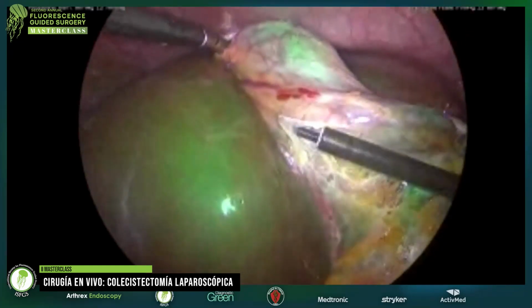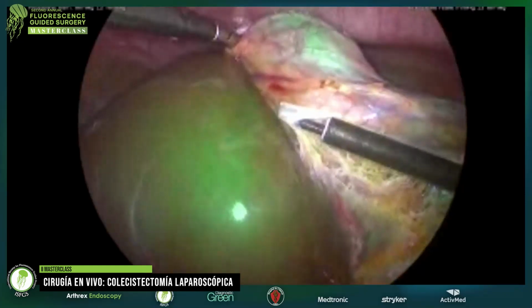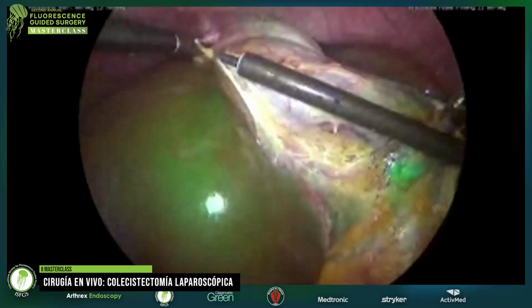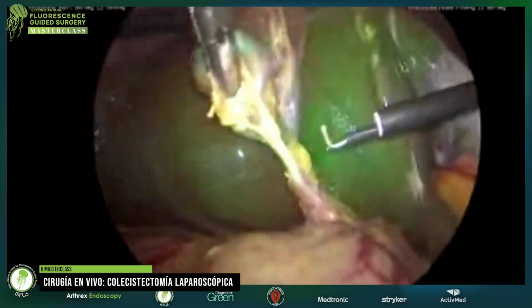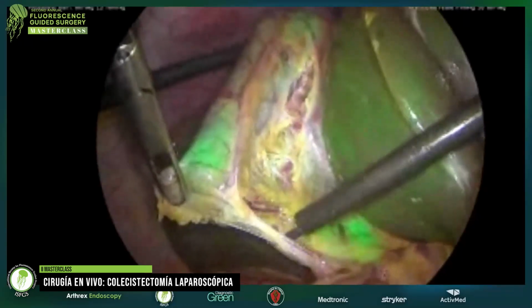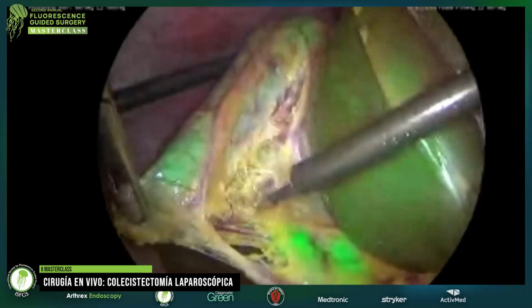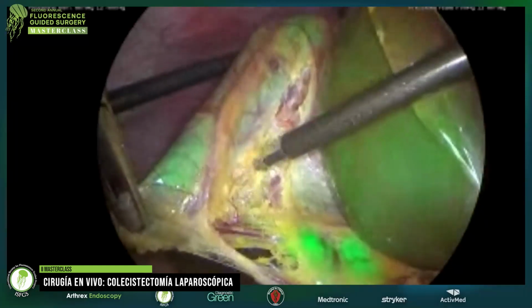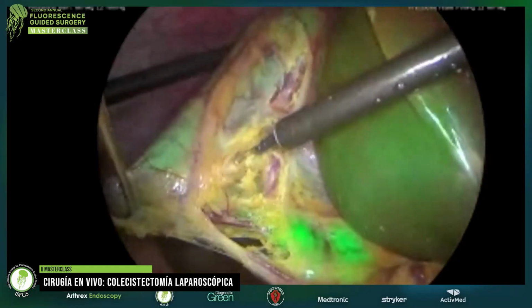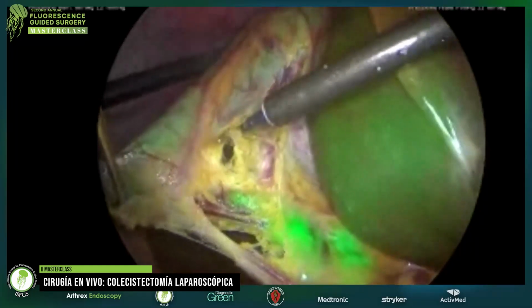Can I make a comment? Of course. Well, the result of this kind of view that we obtain with such a low dosage are very interesting because they come from a study that Ludovica ran. It's interesting because it can be applied to any patient because it's related to the body weight. The results of this study are published in Surgical Endoscopy. The aim of this study is to try to obtain the lowest possible dosage in order to not have any fluorescence, or very little fluorescence, in the liver, and a very high fluorescence in the biliary tree.